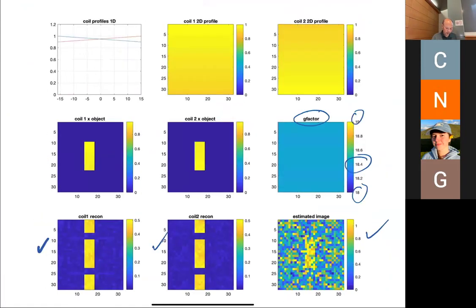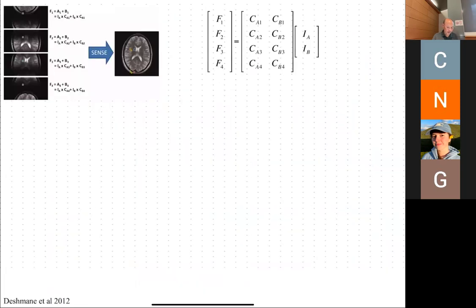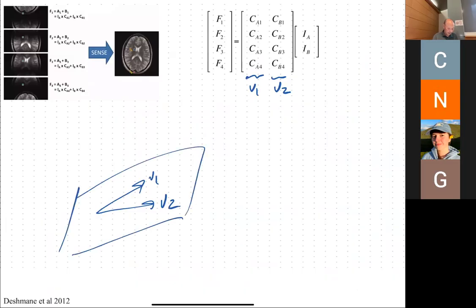So we're going to skip all that, and we're going to come to here. Basically, that's what I just said: let's call this vector one and this vector two. So imagine I have these two vectors, and they lie in some plane, and I have some measurement S. I'm looking for the estimate, the sum of those two vectors, that gives me the minimum error.